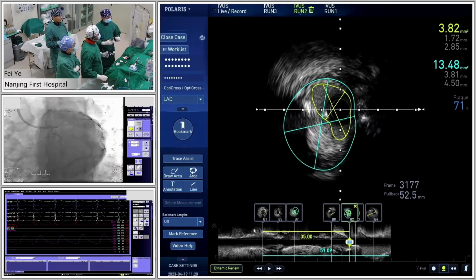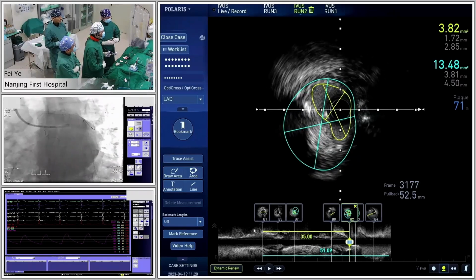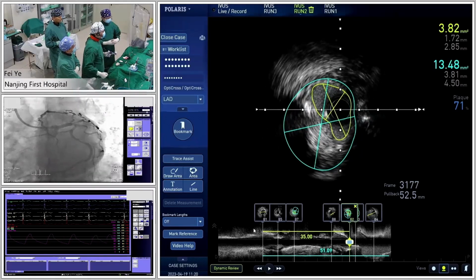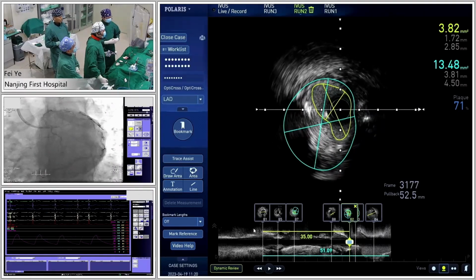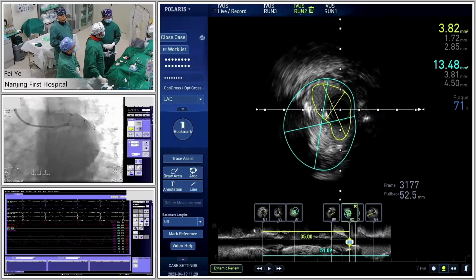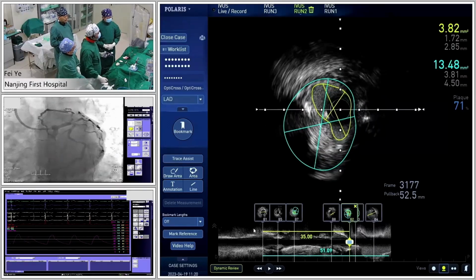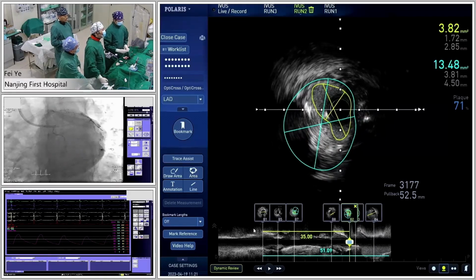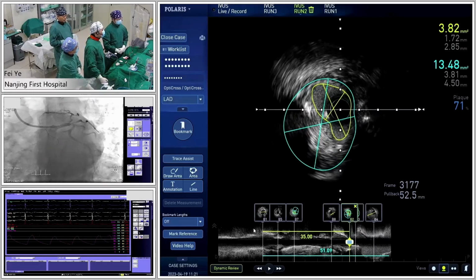So if the POT tactic was not corrected, maybe there is damage to the left main. I think if I treat, I will use a longer stent to cover the whole left main. Usually, if the left main length is less than 8 millimeters, for any kind of provisional stent technique, fully covering the whole left main is acceptable.